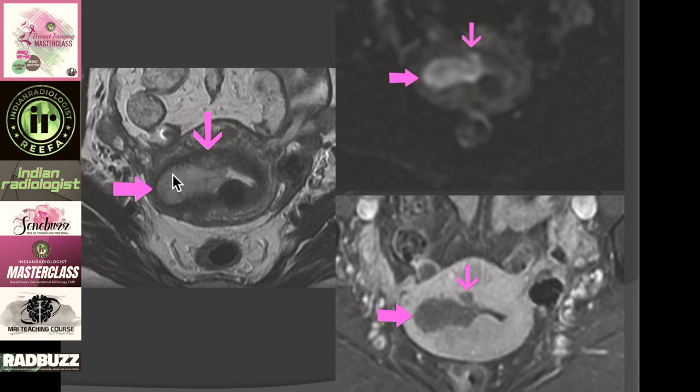So we can see the tumor is here to the right side of the uterine corner and in the middle of the endometrial cavity. And then we have this junctional zone, which is low T2 signal around the tumor and the endometrial cavity. We do see there's a restricted diffusion within the tumor, and there's some nodular component here on contrast enhanced scan. So there's definitely a tumor. Now we need to decide whether it's stage 1A or stage 1B.